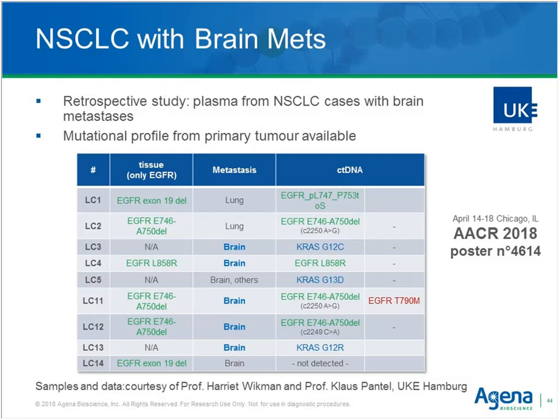The hypothesis being there's a brain-blood barrier, and it's probably very unlikely to detect any ctDNA. We were getting these samples, and as you can see in this table, we were not only able to confirm the majority of EGFR sensitizing mutations that initially had been detected in tissue before the therapy started for these cases, but due to the fact that our panel offers more than just EGFR mutations, but also KRAS content, for instance, we were able to find mutations that were not known previously, which you see in blue in the right-hand side column.